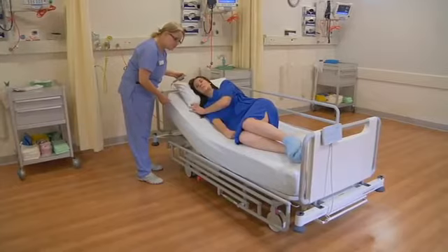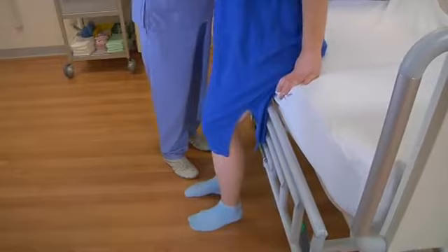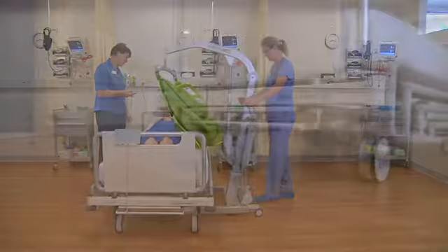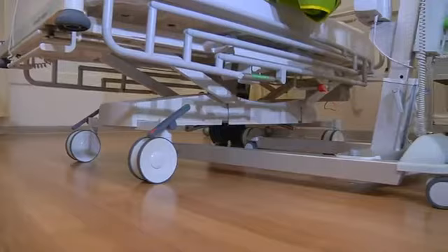Recognising that patient handling and lifting are key issues for medical professionals today, the M9 dramatically reduces the amount of manual handling of patients. The new bogey means that at all heights there is an ample 140 millimetre under-bed clearance, enabling a wide range of patient handling equipment to be employed to move bed or patient with the utmost efficiency and safety.